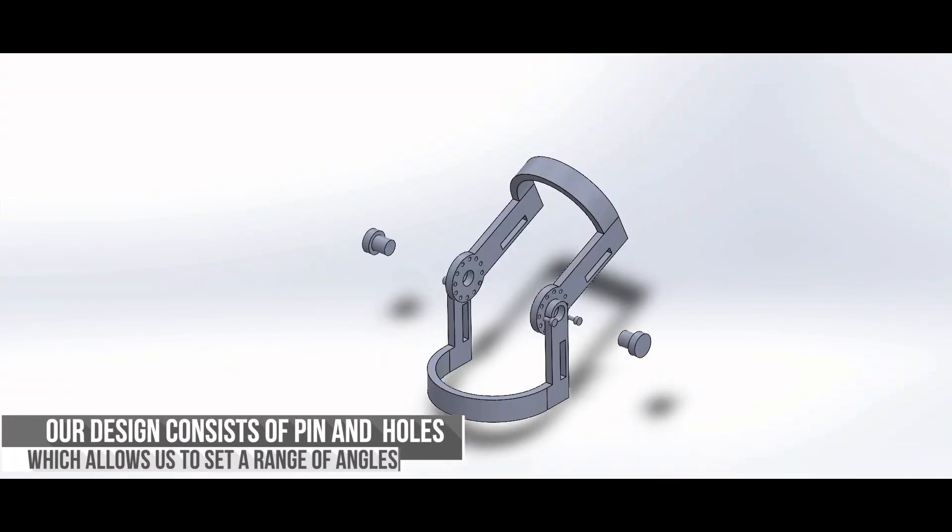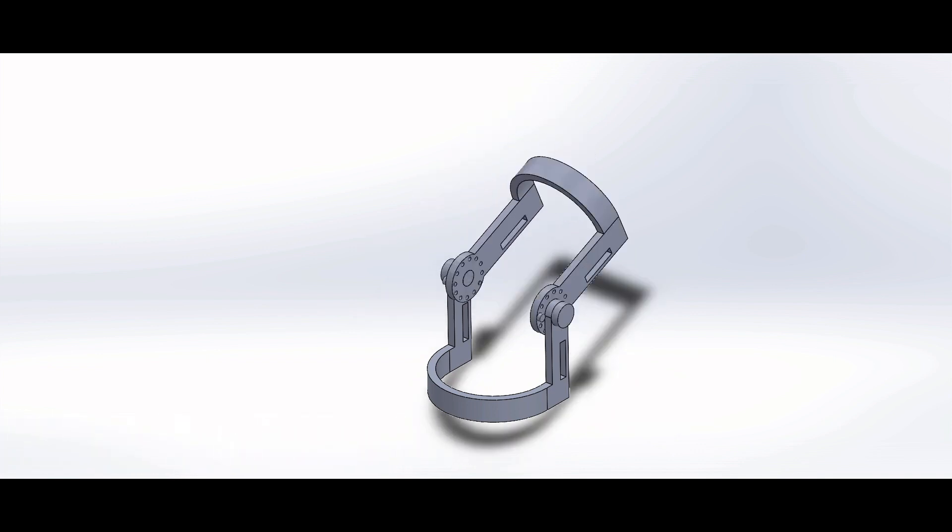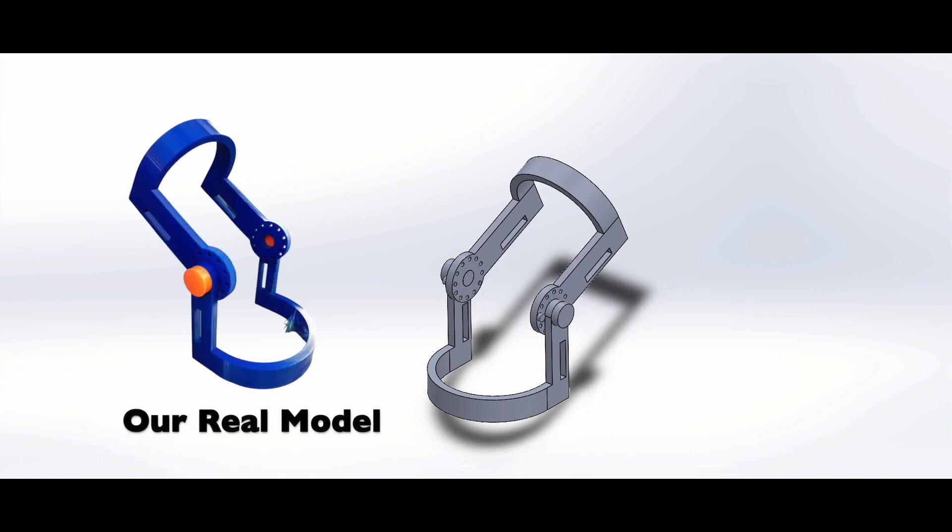This is a SolidWorks model of our design. It consists of pins and holes — this is how the patient is going to set the range of motion and set the angles that will restrict flexion and extension. And this is an image of our physical prototype next to our SolidWorks model.